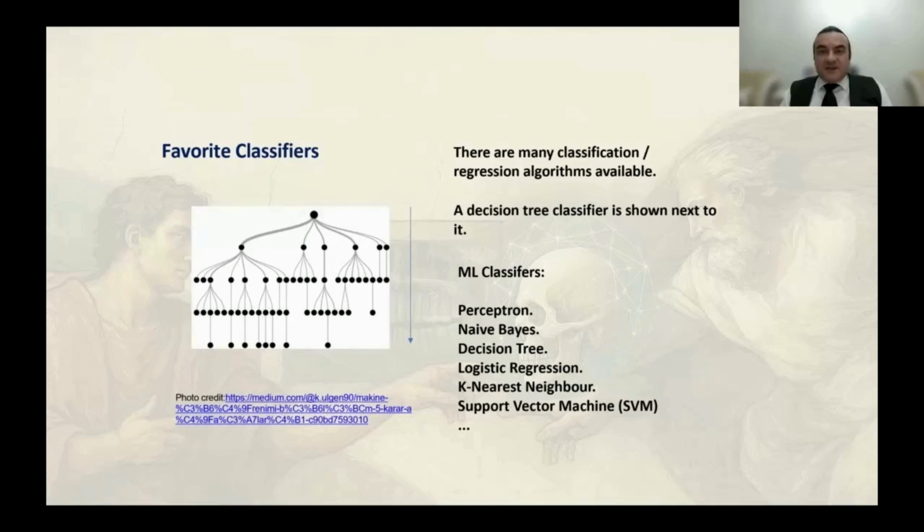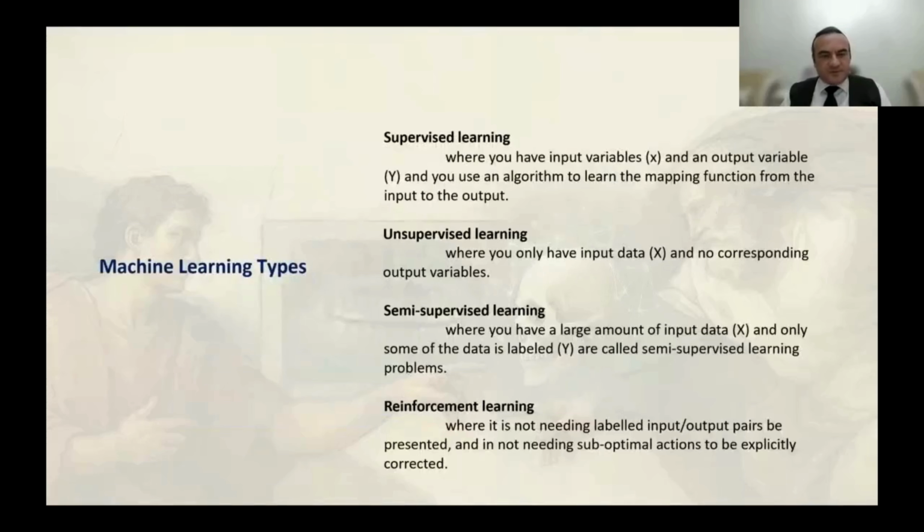Of course, the classification and the feature extraction are the most important parts of machine learning. Out there are many classification and regression algorithms, as I mentioned, like naive Bayes, decision tree, logistic regression, random forest, and so on. You can test all these kinds of classifiers for your machine learning, and out of it, you can pick the best classifier for your purposes.